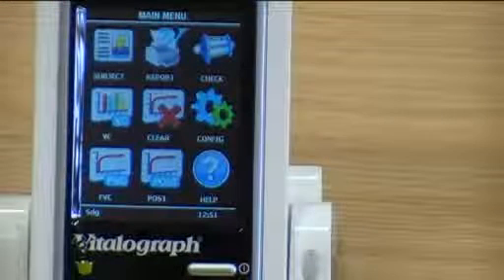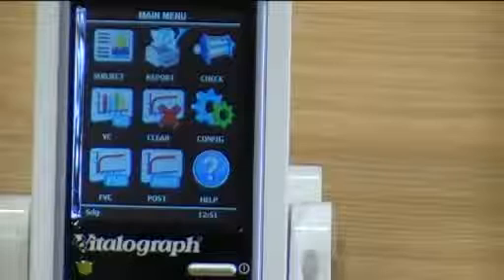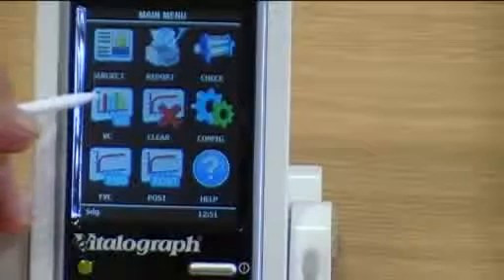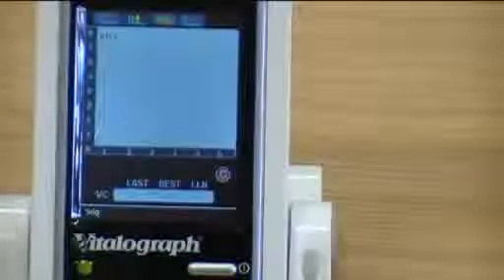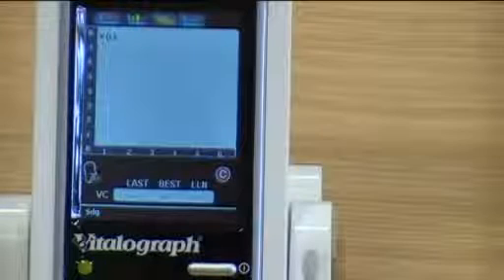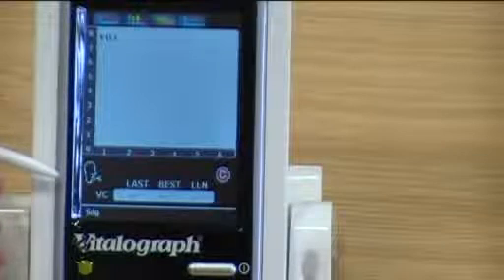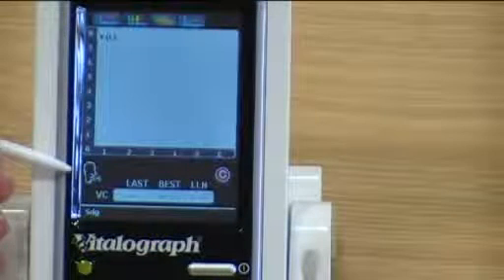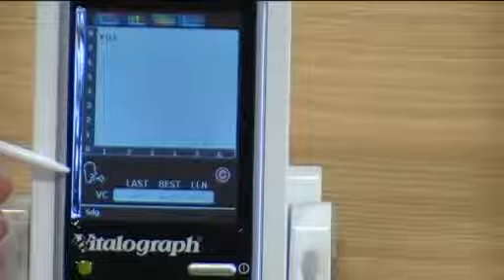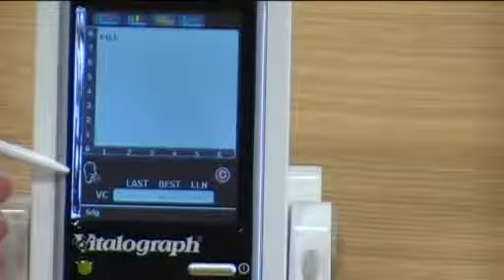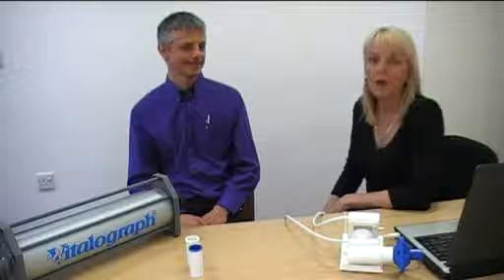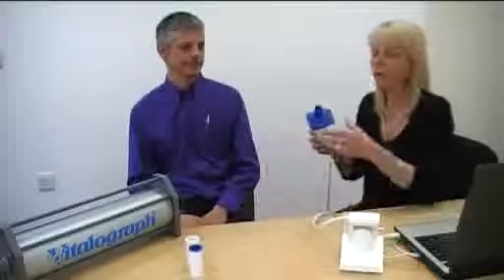To commence testing, one will select the vital capacity icon. On the bottom left-hand side of the screen you will see a blow icon. This will indicate that the device is ready and the subject can now blow into the spirometer. We will now do a vital capacity. One needs to take the flow head from your spirometer with your bacterial viral filter and pass this to the patient.